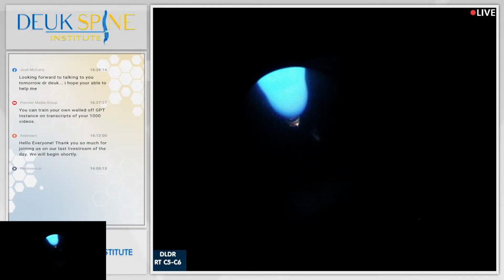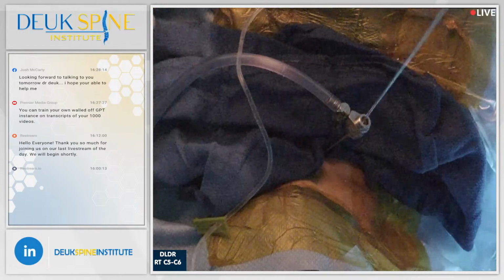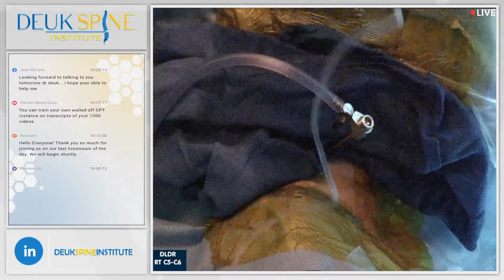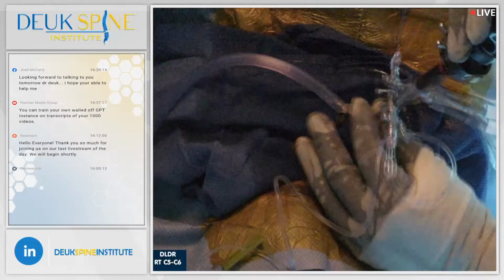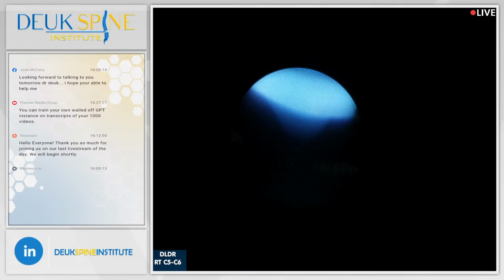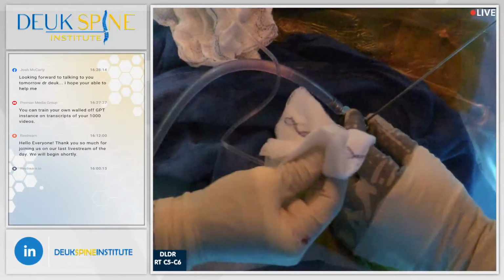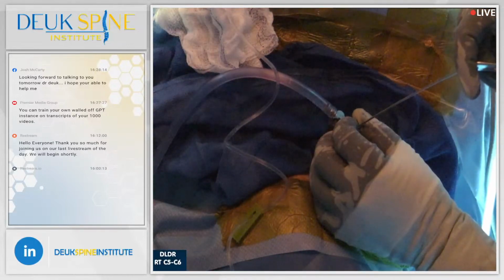Okay, welcome back. You see now how an annular tear at the back of a disc that gets a herniation in it can cause so much pain. And I'm here with the scope at the back of his disc where the tear is causing all of his pain, and he keeps getting these herniations popping out, but they're still scarred down to the annulus. They're not coming out. I'm having to go in with a laser, and there's one right there. Look at that thing. Beautiful. All right, let me try to grab that. Yeah, I think we got one right there. Yeah. Good. See if there's another one.